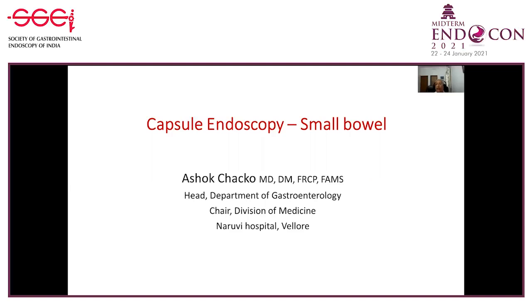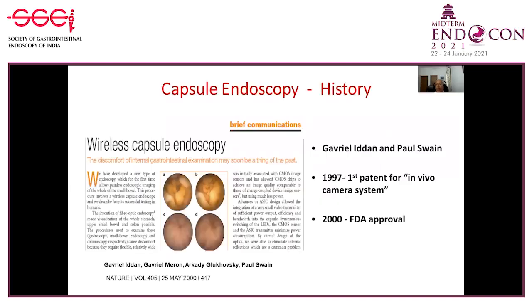It was Gabriel Iddan from Israel and Paul Swain from the United Kingdom who first pioneered and discovered the technique of capsule endoscopy for evaluation of small bowel disease. In 2000, FDA approval was given, and the first publication on this subject was in Nature in the year 2000.